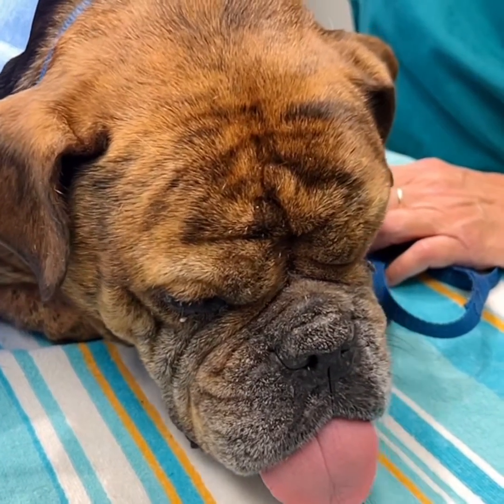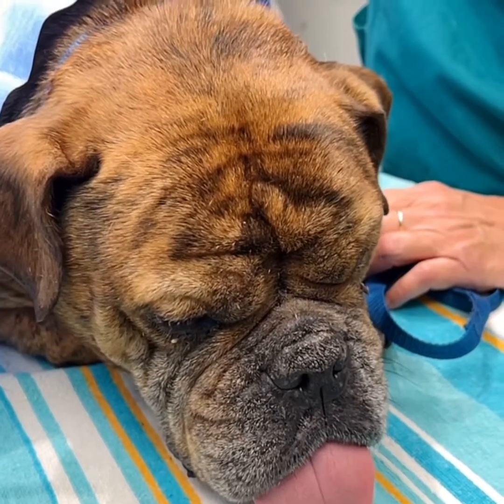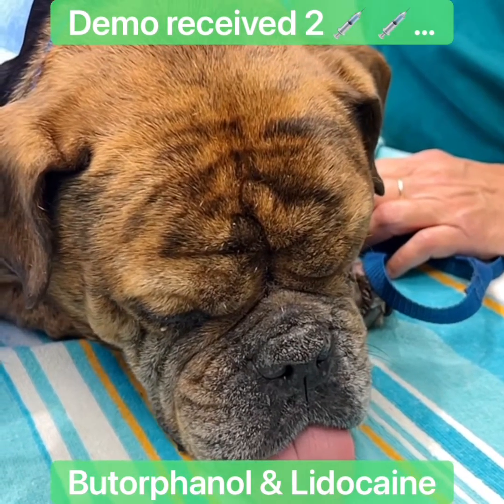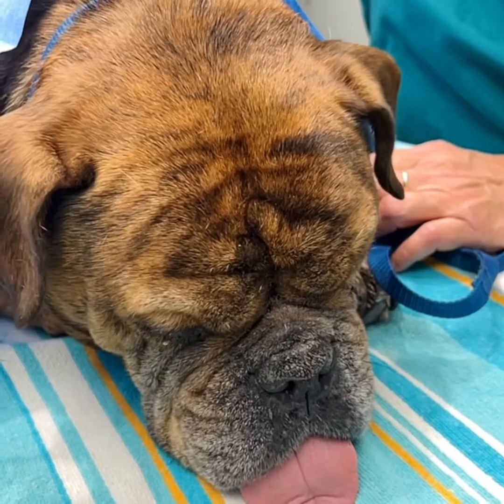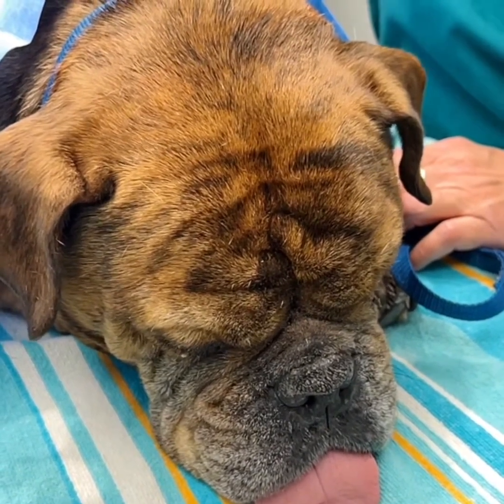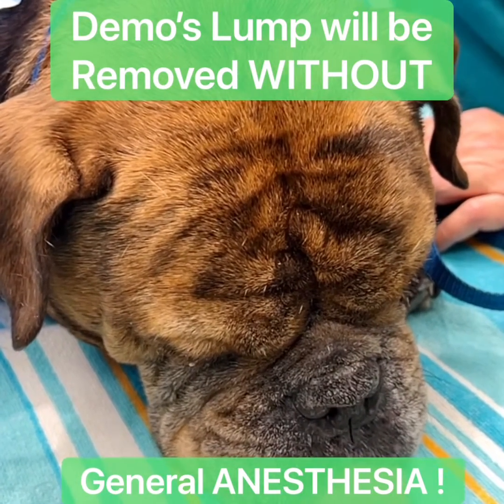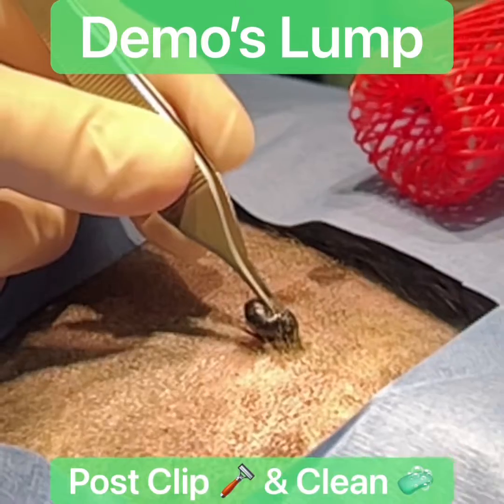Hi everyone, this is Mr. Demo. He is cute as can be and he received a mild sedative of butorphanol and a local injection. We're going to remove a lump from his back, suspected to be a benign dermal mass, and we'll be demonstrating how we use the high power CO2 laser to remove this lump today.